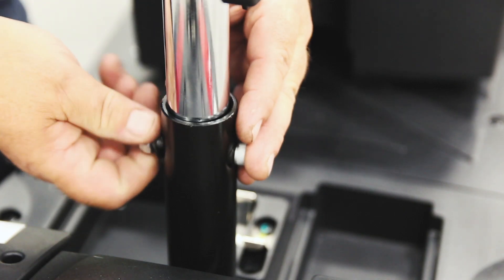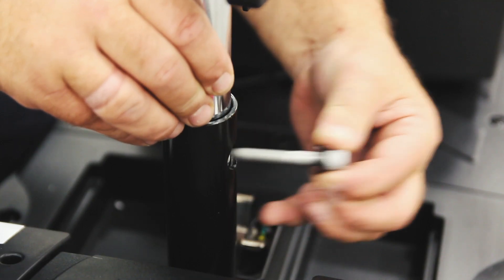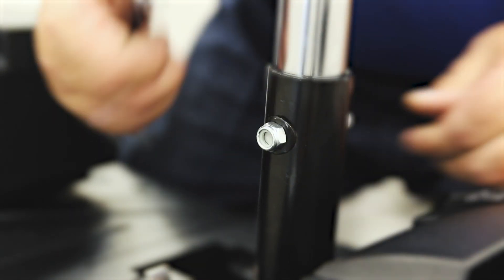To adjust the height of the seat, you'll first need to loosen and remove the bolt. Raise or lower the seat post to the required height and then reinsert the bolt, making sure it's tight and secure.